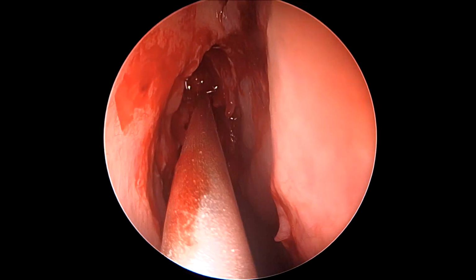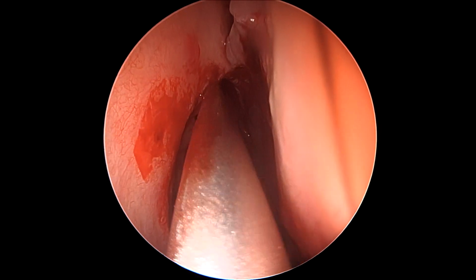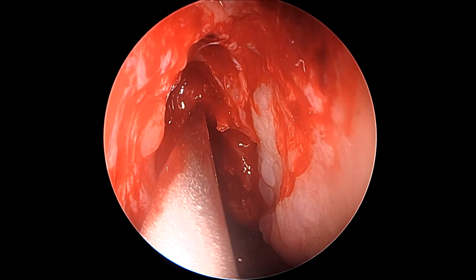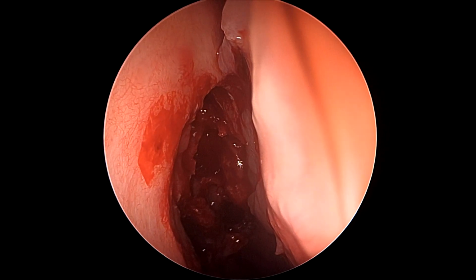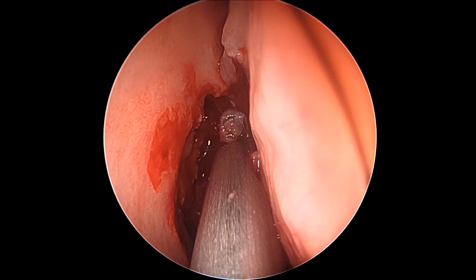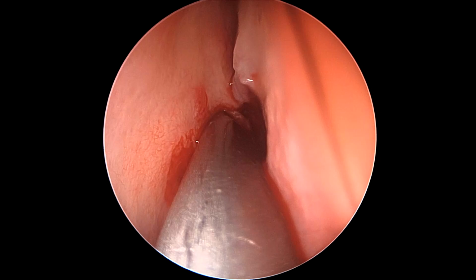Now, as we keep clearing these septations, we can start seeing the trajectory of the skull base as it slopes from anteriorly, which is superior, to posteriorly, where it is much lower. Once again, since we are operating with an endoscope which is two-dimensional, it is very important to preserve anatomy and understand a three-dimensional part of it, which often gets overlooked.